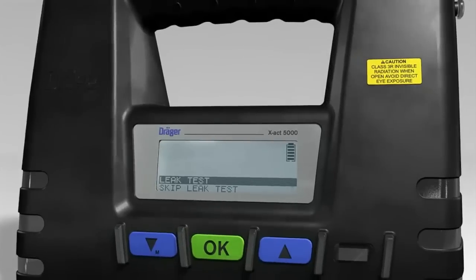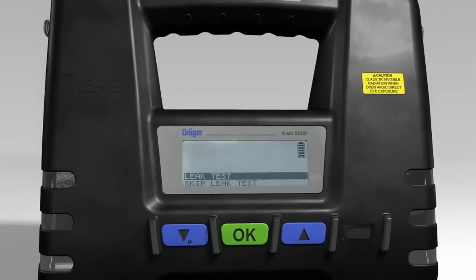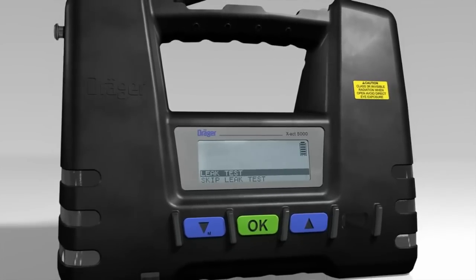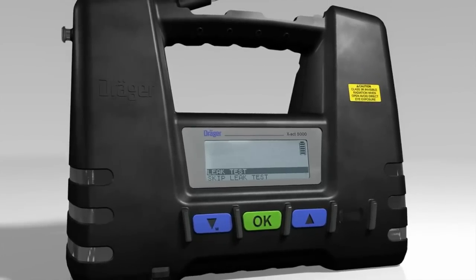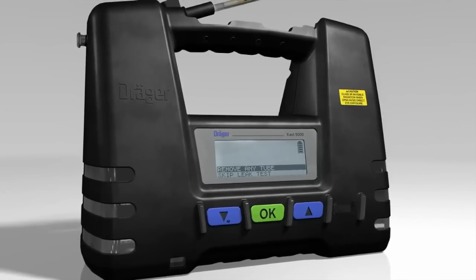After turning on, the message LEAK TEST or SKIP LEAK TEST always appears in the display. Dräger recommends always carrying out a leak test before using the tube pump. Press the OK button when LEAK TEST is shown with a grey background in the matrix display.